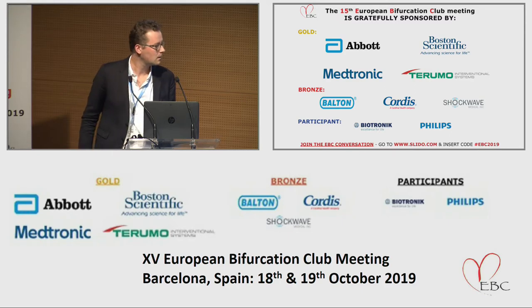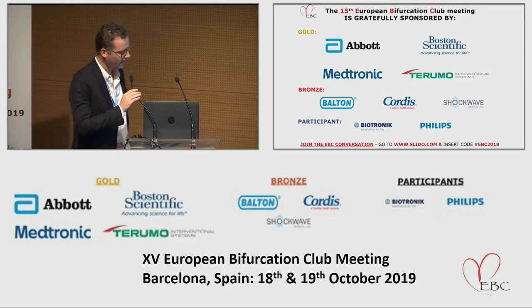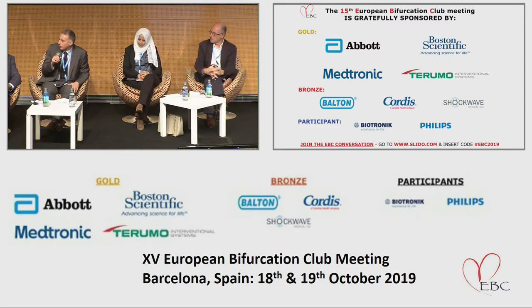Okay, thank you. I think that all of this, however, should be put into the perspective of an undiseased left main or proximal main vessel, because as soon as you have the plaque, it's a different story. You should scaffold with your balloon also the plaque, not only the stent struts.